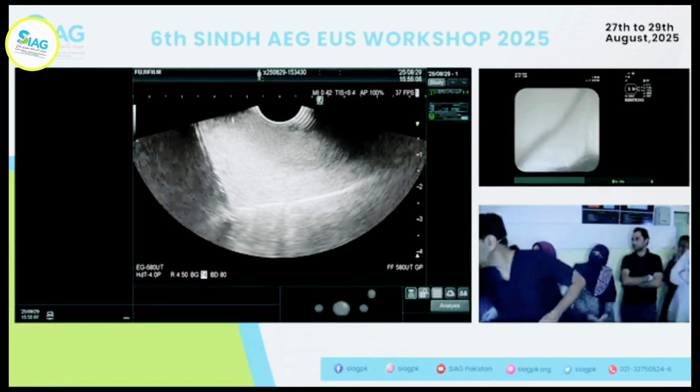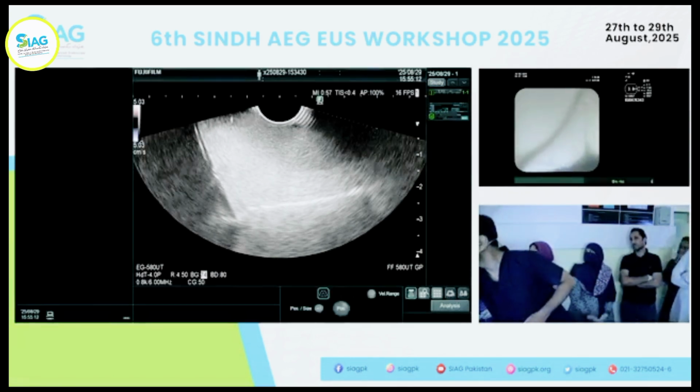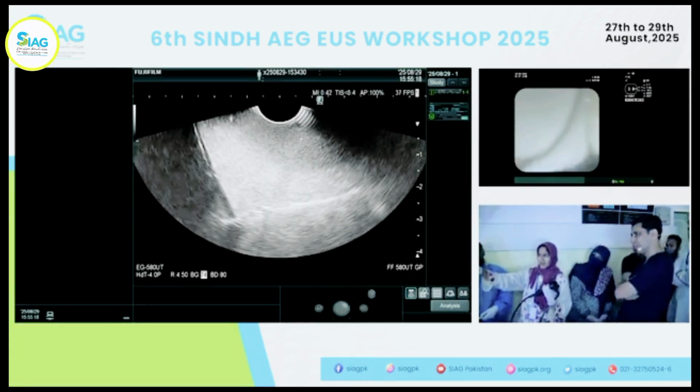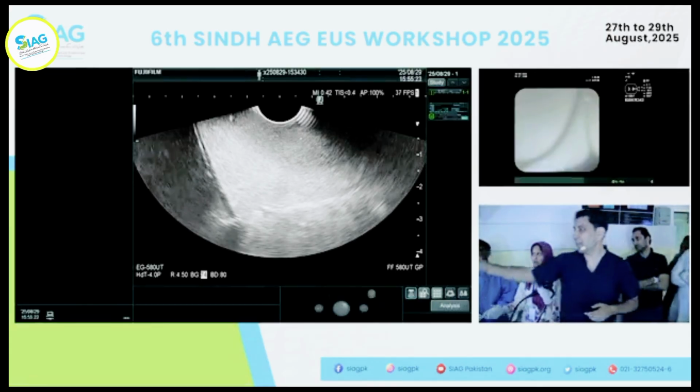So let's put the Doppler on, E-flow. Okay, so we've got the Doppler on. Good. There's nothing there. I'll either see the distance or I'll just make a mental note. Like I feel that 5 centimeters would be safe. Yeah, I think I agree.